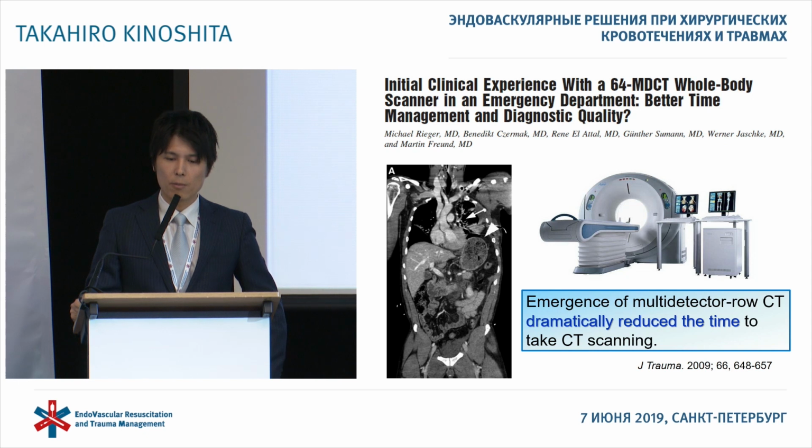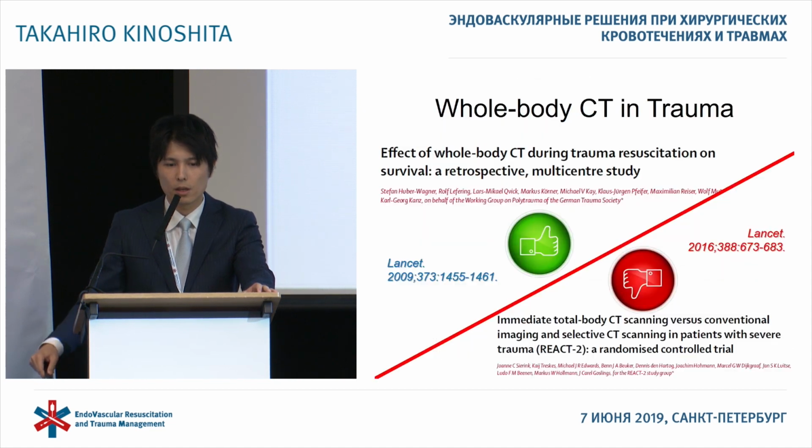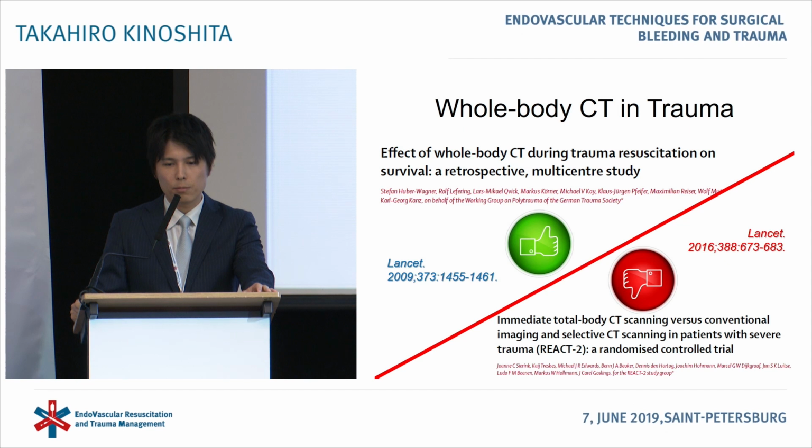But the emergence of MDCT dramatically reduced the time to take CT scanning, so now we can obtain high-quality images within a short amount of time, so the situation has changed. And recently, two important studies were published in The Lancet, but the effect of whole-body CT scanning during trauma resuscitation is still under debate.